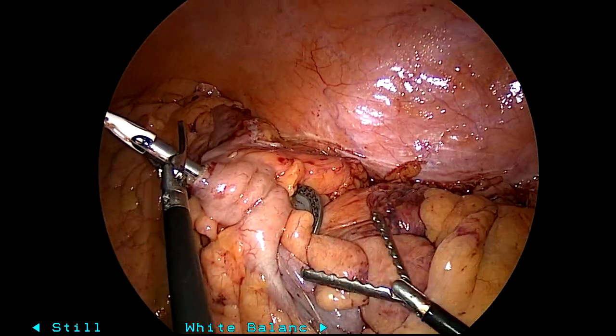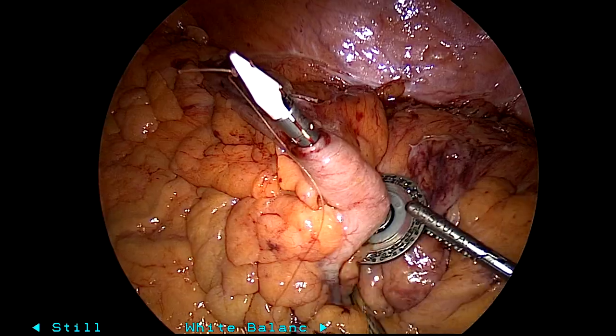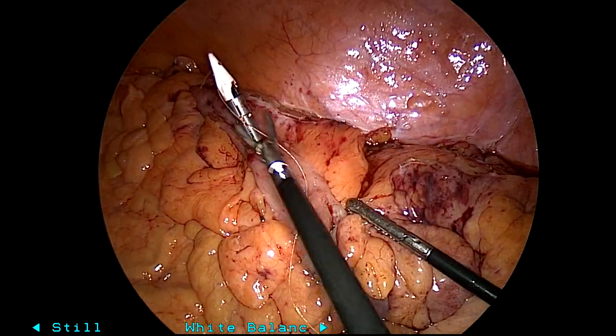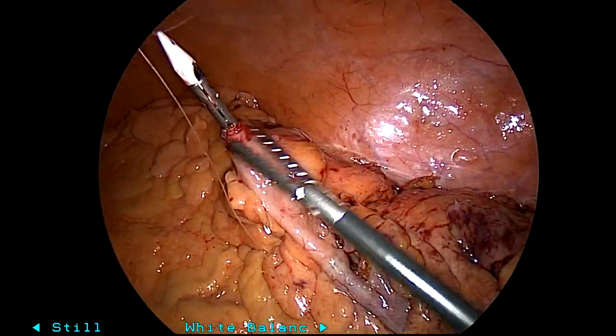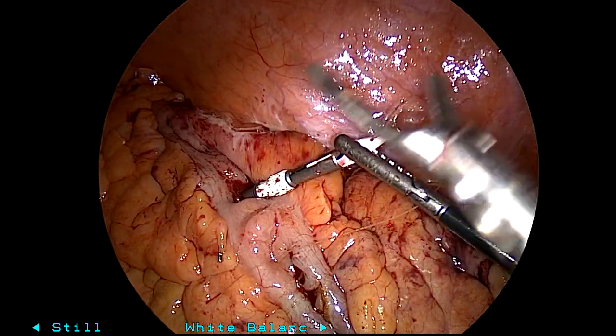I like to do a Baker technique. I think it's the absolute easiest way to get an anvil in intracorporeally, laparoscopic or robotic. You see it happen right there — the anvil was placed through the Pfannenstiel incision, which was subsequently going to be used for specimen extraction.